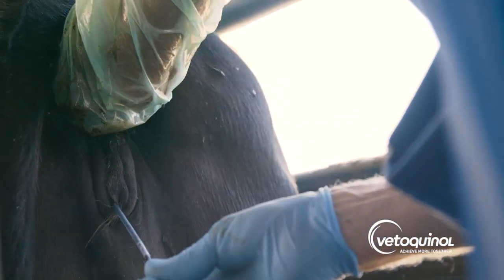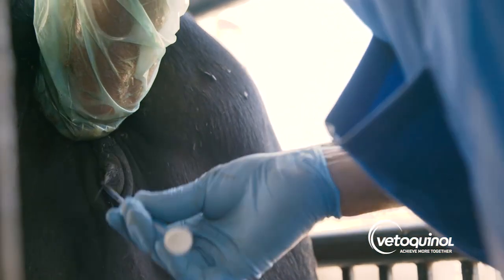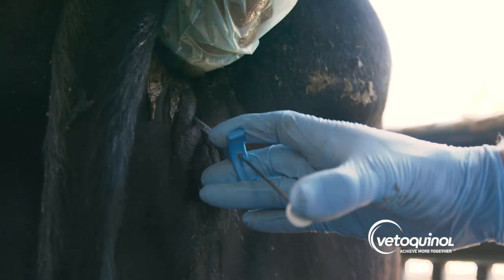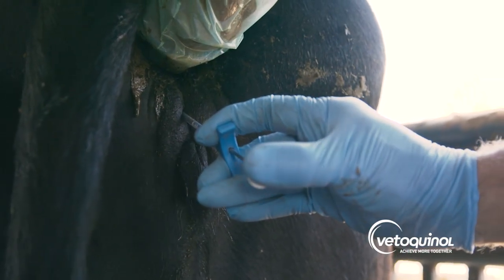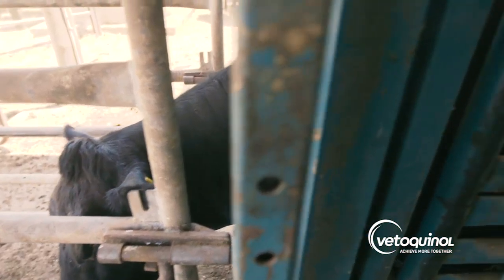Once the tip of the gun is completely through the cervix, the technician deposits the semen in the body of the uterus by pushing the plunger on the AI gun. The cow has now been artificially inseminated.